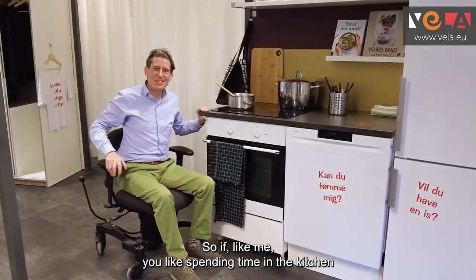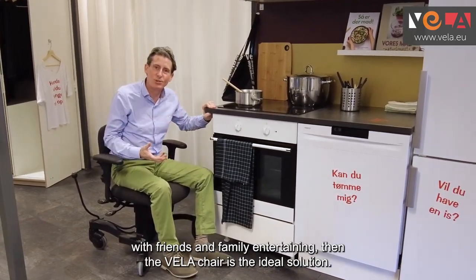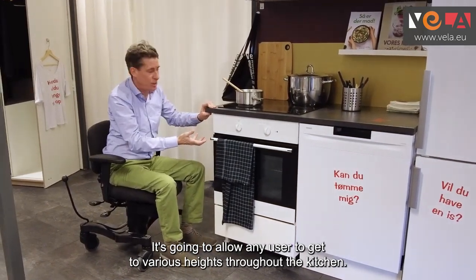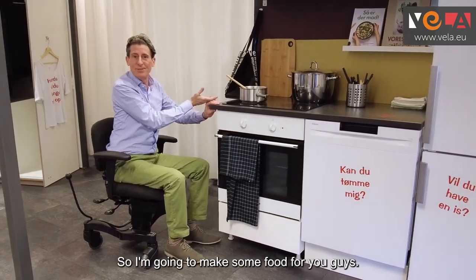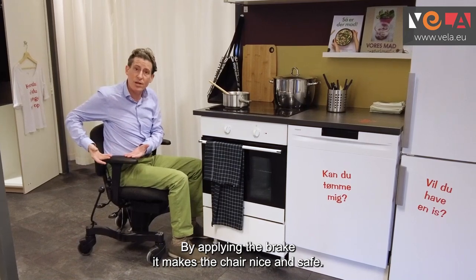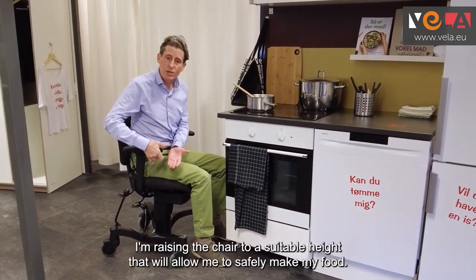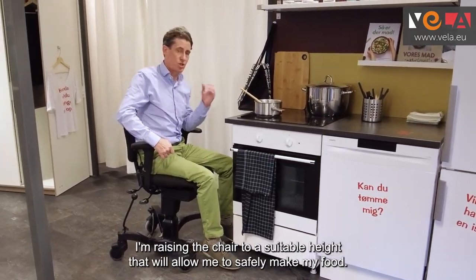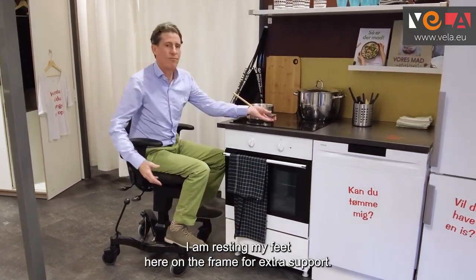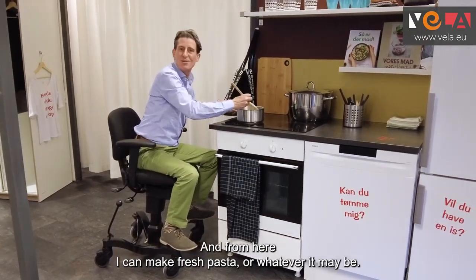If, like me, you like spending time in the kitchen with friends and family entertaining, then the Vela chair is the ideal solution. It's going to allow any user to get to various heights throughout the kitchen. By applying the brake the chair is nice and safe — obviously hot pans are in the kitchen so we need to be secure. I'm raising the chair to a suitable height to safely make my food, resting my feet on the frame for extra support, and from here I can make fresh pasta or whatever it may be.